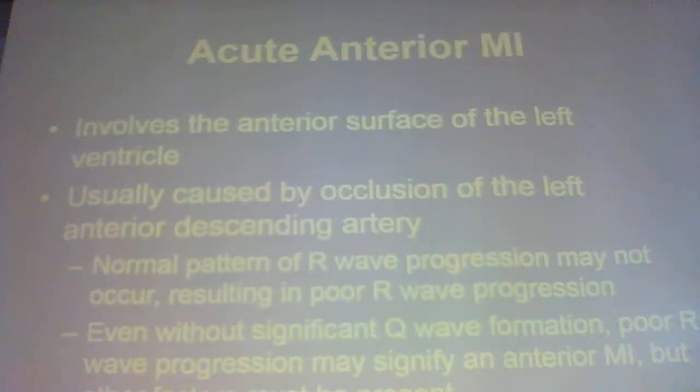So, anterior infarct, where am I gonna see elevation? V3 and V4. Which artery is involved?